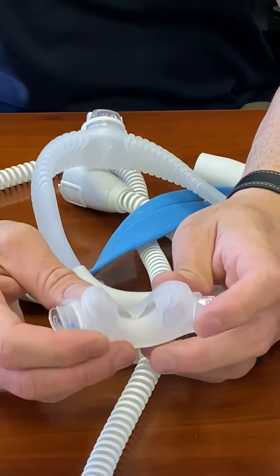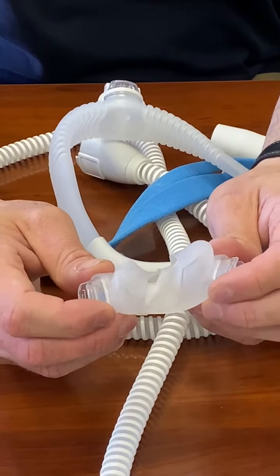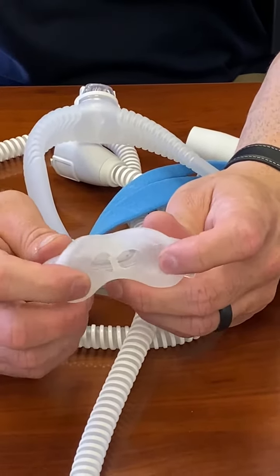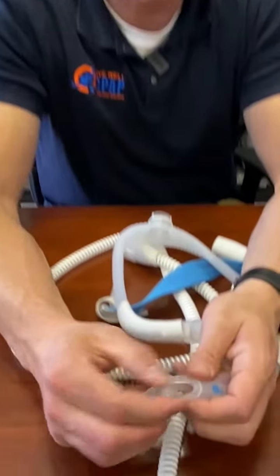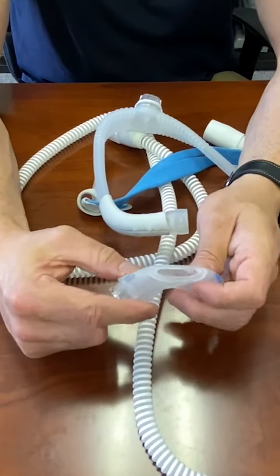To get in and out of the mask — if you want to talk to somebody or use the restroom but don't want to take your interface off — if you squeeze up here on the top on each white button, it's going to pop out. You can actually leave that in the tube and put it back on when you're ready to go back to sleep.